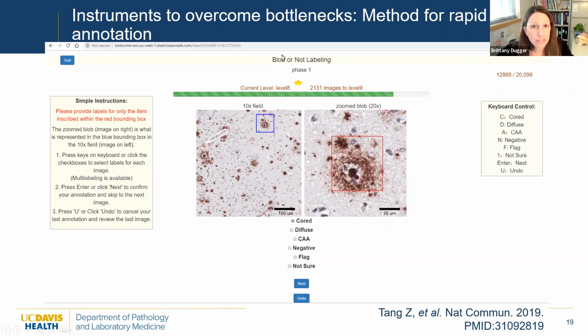So this was very great to, again, have that diverse team where we talked about everything. We actually deployed an annotation platform using AWS. This is an Elastic Beanstalk website. So just think of when you're looking on Amazon or Netflix and you can flick through things really, really quickly to make a choice, kind of thinking about that same concept. And so here we can show just single images, making sure things go very quickly. Even from a categorization standpoint, I could come over here and click these categories every time, but that's going to take time.